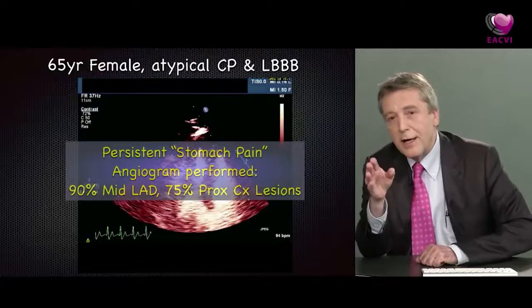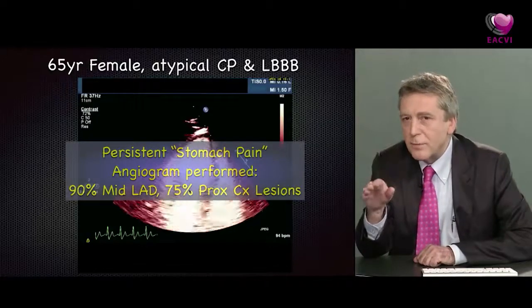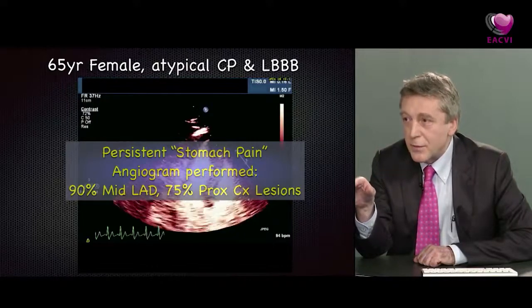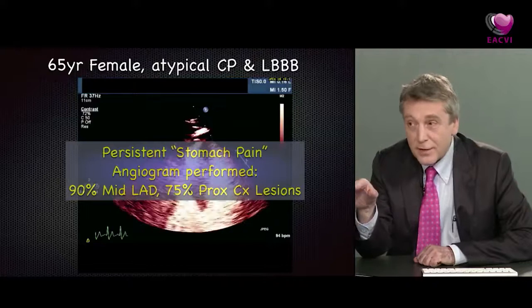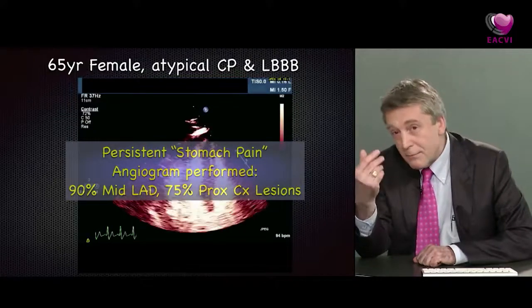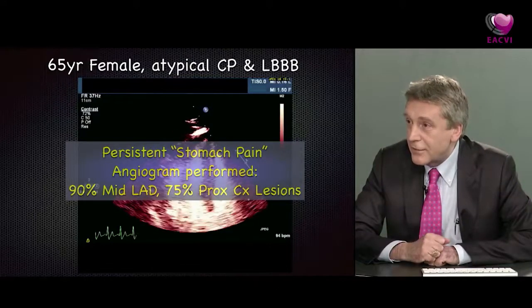Now, what I didn't tell you completely was I said we stopped the stress echo because the patient was experiencing stomach pain and said it was really uncomfortable. So we actually didn't get to peak stress. And if we'd been able to do that, then we may well have had the wall motion abnormalities. Yes. But MCE rescued the story for us and gave us the diagnosis.